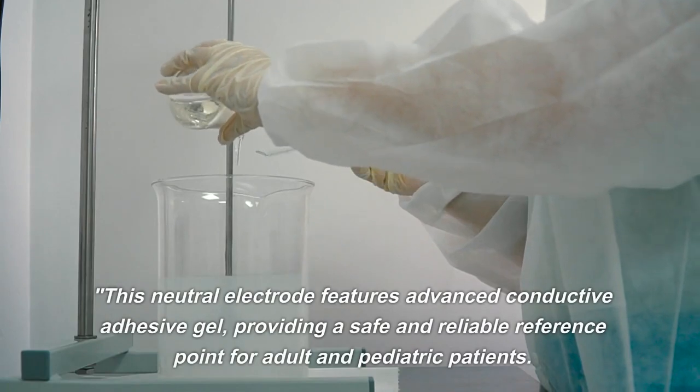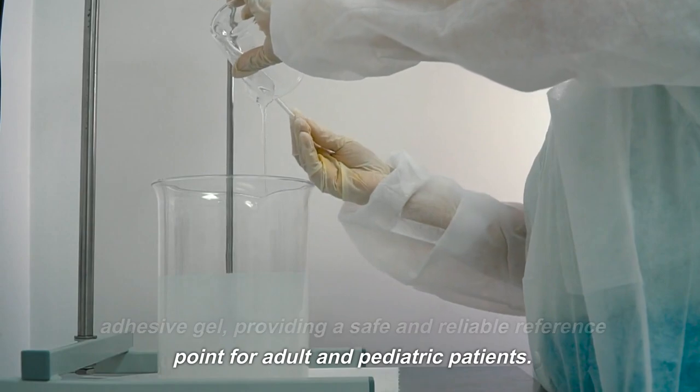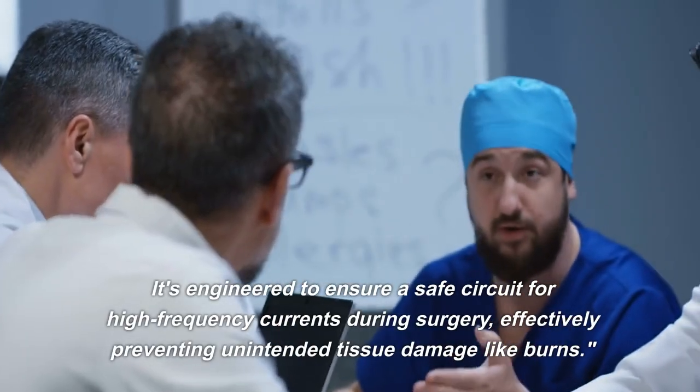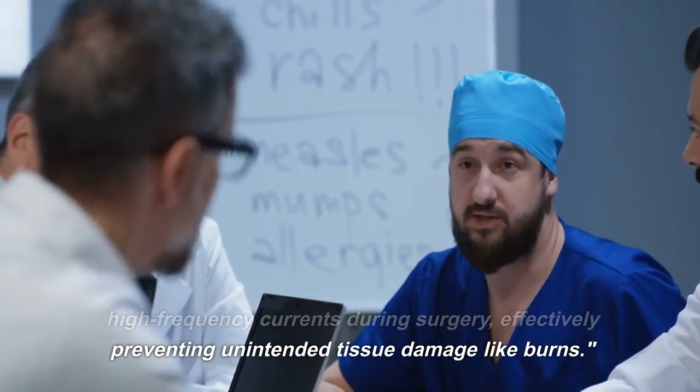This neutral electrode features advanced conductive adhesive gel, providing a safe and reliable reference point for adult and pediatric patients. It's engineered to ensure a safe circuit for high frequency currents during surgery, effectively preventing unintended tissue damage like burns.